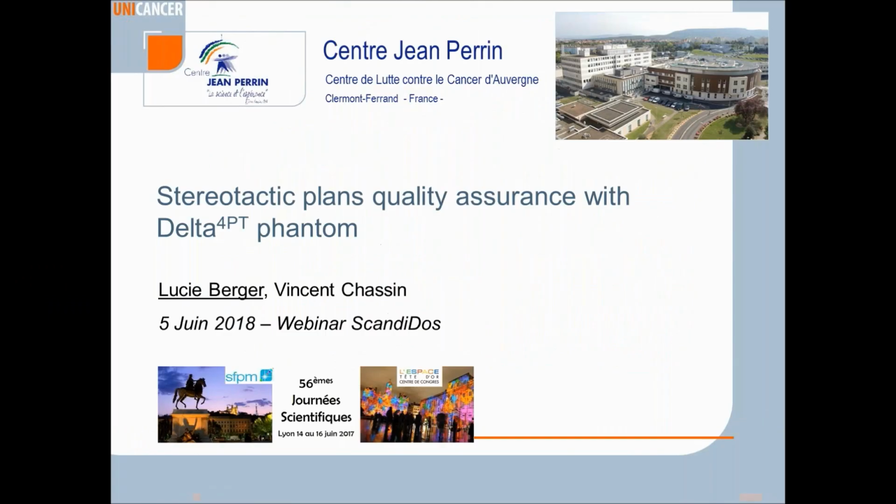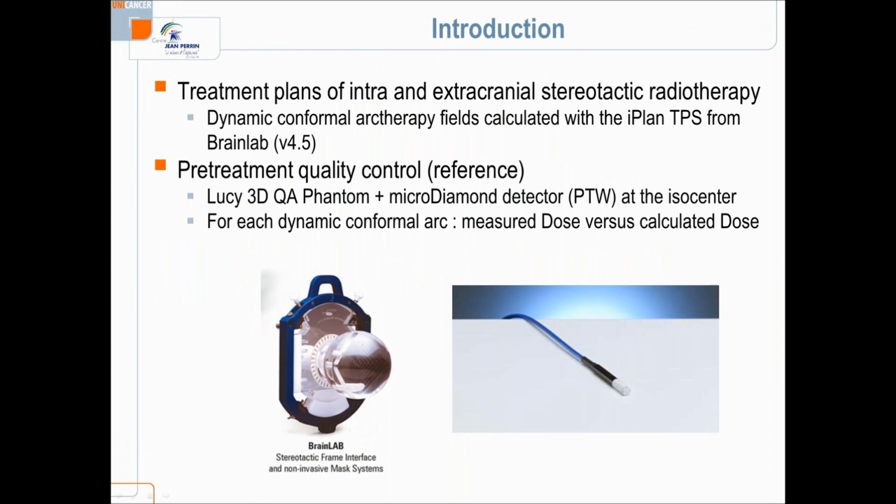I'm going to present you a study of quality assurance of a stereotactic plan with Delta4 Phantom. So in our center, the treatment plans of intra or extracranial stereotactic radiotherapy are realized with dynamic conformal arc therapy fields. They are calculated with the iPlan TPS from BrainLab.